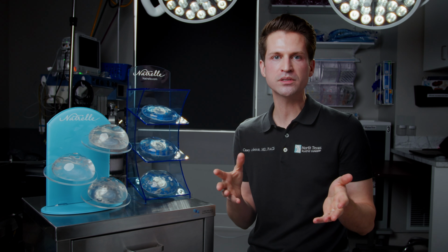If you go to multiple consults, you'll get several numbers that are relatively close, but different. I don't think we have to be super rigid in picking the implant that's the exact number, because even if I measure you 10 times, I might get 2 or 3 different numbers myself. So we need to pick something that is close to that and is going to help you get there.